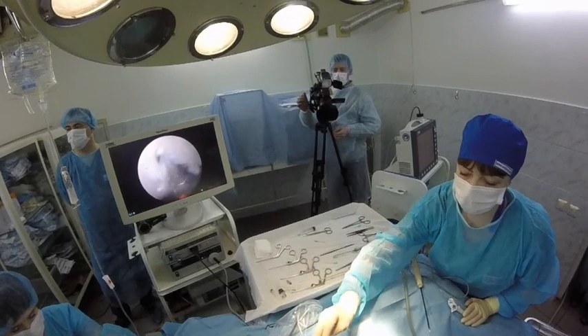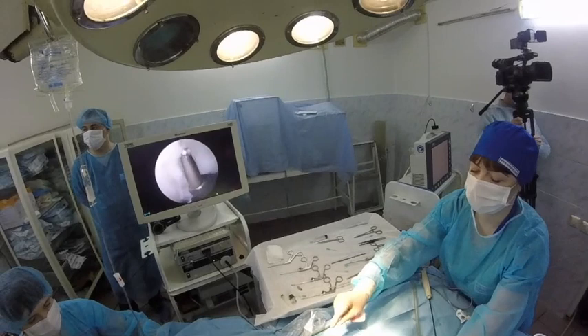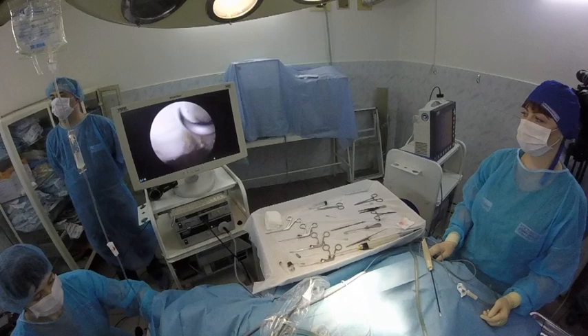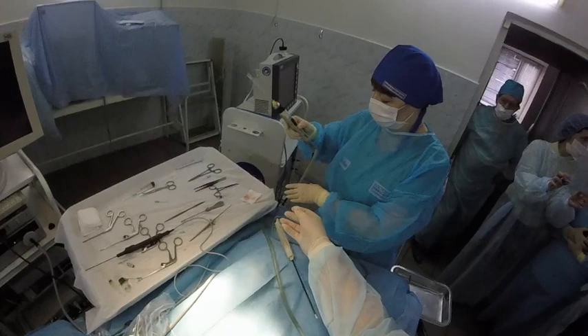This is the problem, as you see. We find the problem. I need a grasper. Can you give me a shaver? Now we will use a shaver. Everybody — we find the problem. This is a very rare clinical case. We find fragmentation of the caudal part of the glenoid.